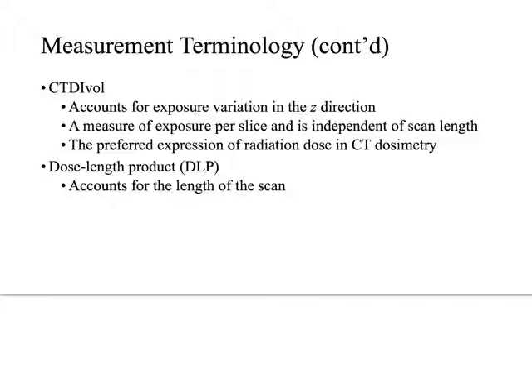So right now what I'm saying is CTDI volumetric is kind of the gold standard. It's the one to be aware of, the one to understand. Prior to initiating any CT scan, any CT examination, the CT scanner has to tell you this is the projected CTDI for this exam. It will say, this is what I anticipate the CTDI will be for this exam. It's a weighted average. Is it 100% accurate? No, it's not. It's just a weighted average.